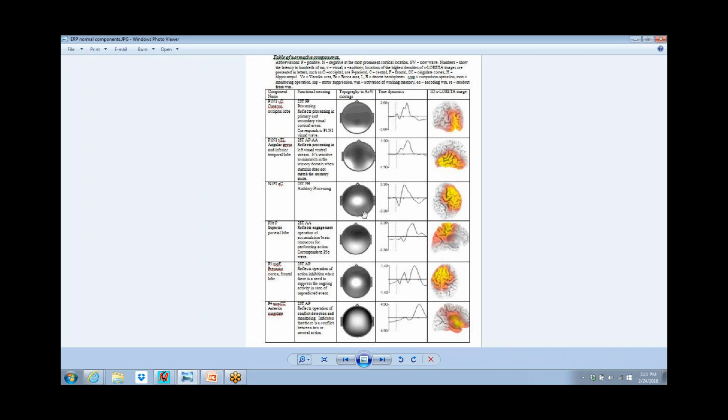This is an auditory oddball. Every once in a while, the task tosses out an oddball tone as a distractor. And this is early, like a sensory stimulus, but auditory stimuli are actually picked up on the top of the head. And you might go, well, that's not where the auditory cortex is. What the hell are you doing up there? These potentials are picked up because the auditory cortexes are enfolded into the temporal-parietal junction, and they're both pointed up to the top of the head. So you see the potential on the surface up here, even though the source is buried in the temporal-parietal junction. Auditory potential can be seen at the vertex.